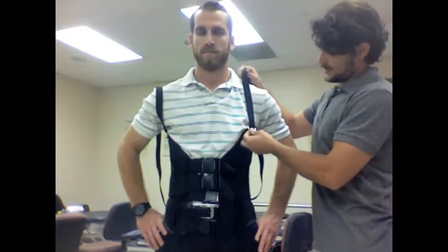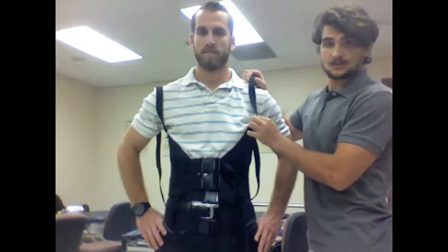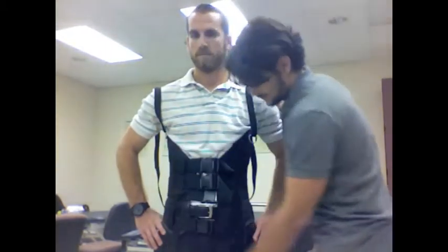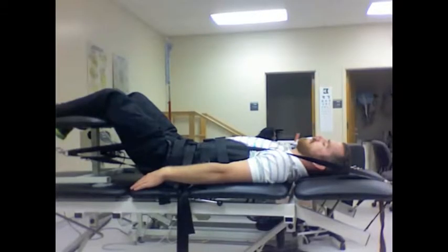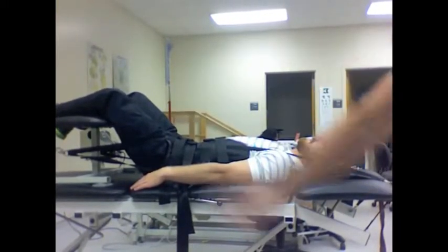Before we start treatment and lay the patient down, we want to make sure that these silver clamps are facing on the front side of the patient at both the lumbar belt and the thoracic belt. Now that we're ready for treatment, we've made sure that the patient's thoracic belt has been fastened securely to the head of the table and that his lumbar belt has been fastened securely to the traction machine.